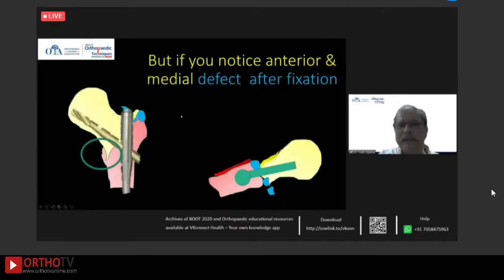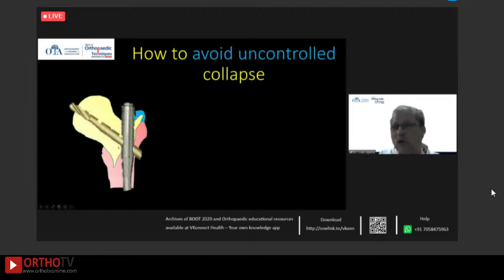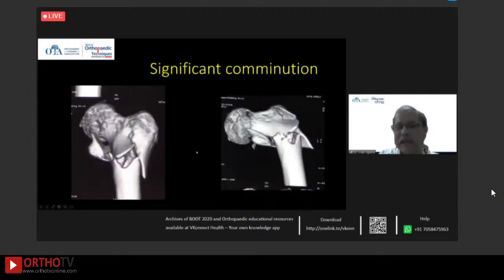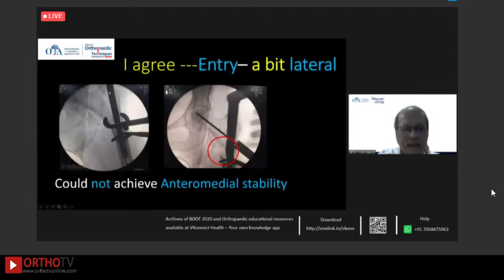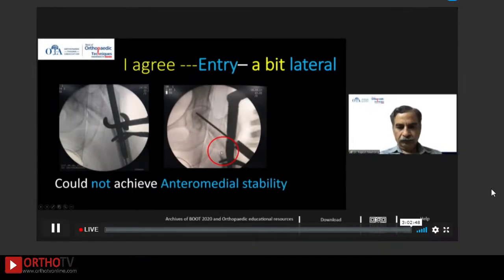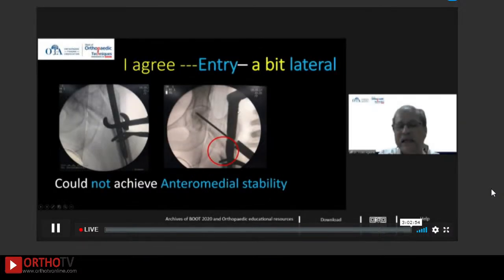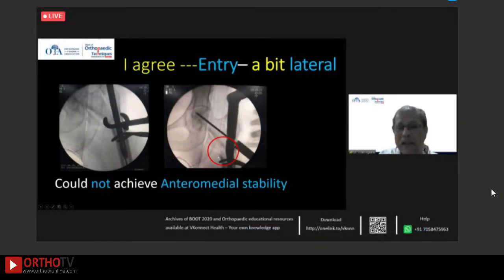Sometimes you notice that you have produced a big medial defect, and of course you are worried that there would be an uncontrolled collapse and a failure. For example, here you can see she has global comminution, an 84-year-old female. Here you can see there's a significant comminuted intertrochanteric fracture. And then I put in a nail, leaving a huge defect anteriorly as well as medially. I agree that my entry was a little lateral. I should have gone a little more medially. But now what do I do?